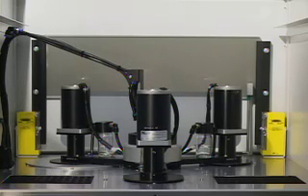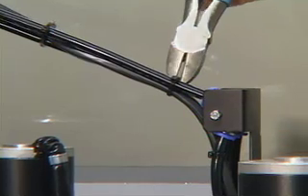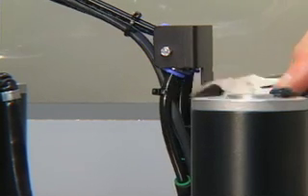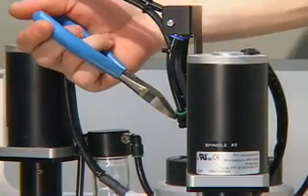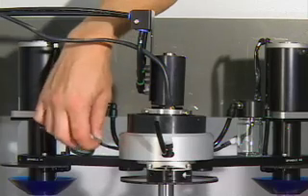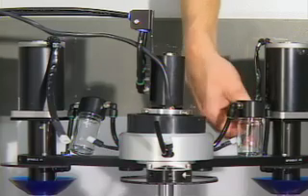Remove HEPA filter and upper back panel. Cut zip ties along vacuum lines and brush block wiring. We removed a spindle motor assembly to improve your view. Unplug spindle motors and coating catch reservoirs. Label tubing and wires.